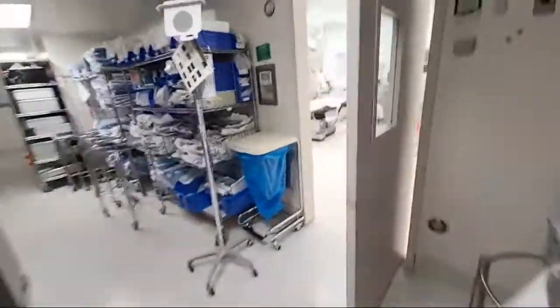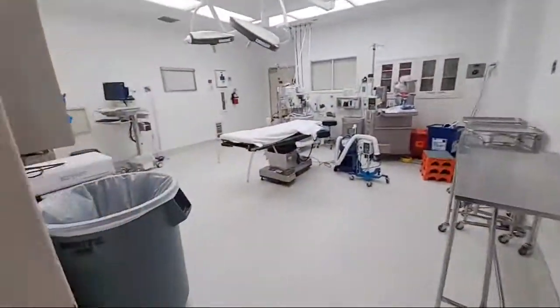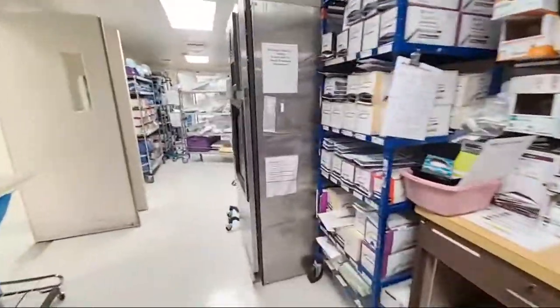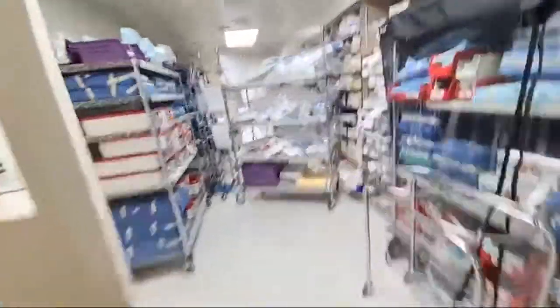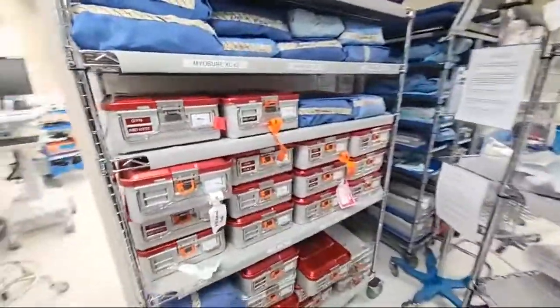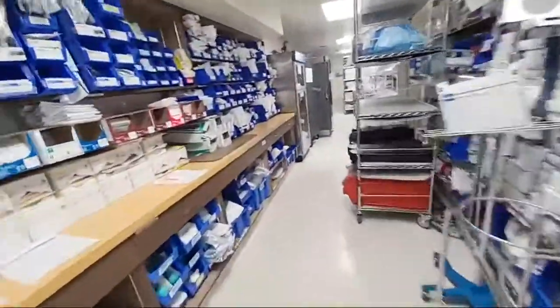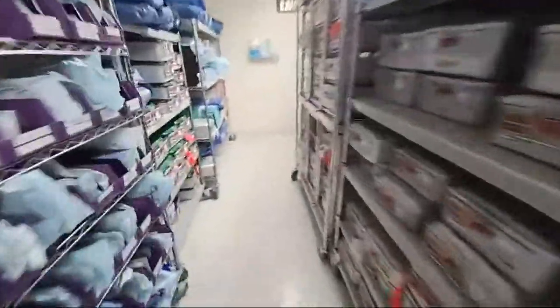Here's an OR. We don't generally ever have to go in here unless it's a delivery, a single instrument needs to be replaced or something, or they're requesting something specific. We need to go in there and talk to them. Yeah, I think that's about it. So here's just more storage, and that about covers it when it comes to the end of the line. And then we're back in decon. Oh, I guess the last thing is here's the flash machine that we try not to use, but it is available for emergencies only, as we are tracked how often we use these kinds of things.